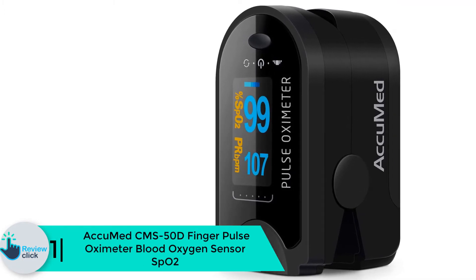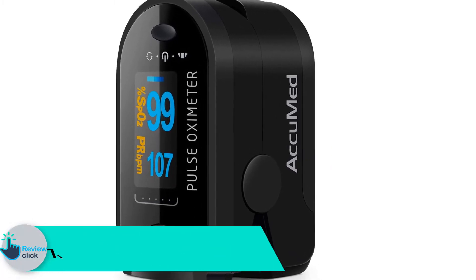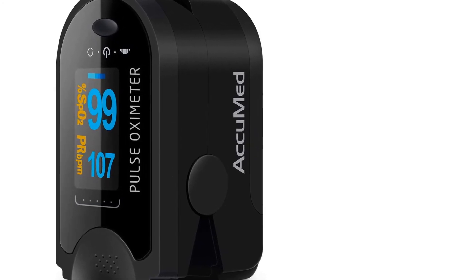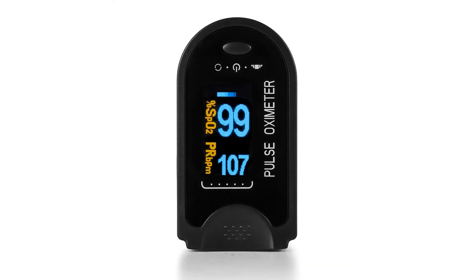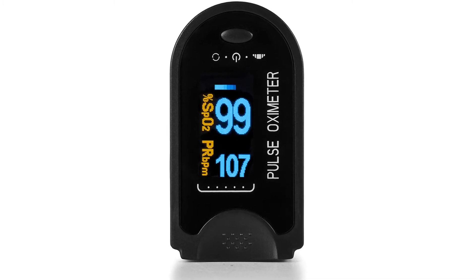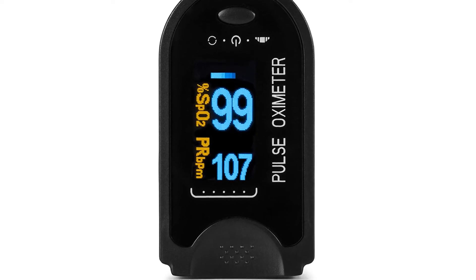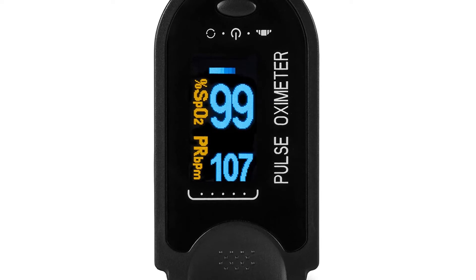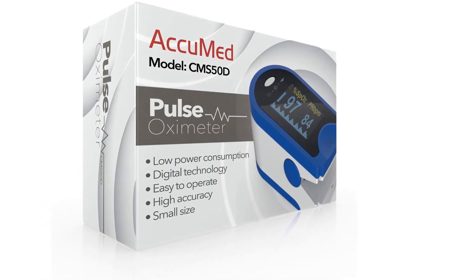Finally, at number 1 we have the Acumed CMS50D Finger Pulse Oximeter Blood Oxygen Sensor SpO2. Acumed brings you convenience when determining blood oxygen level and pulse rate, delivering precise and accurate results. This makes it a great choice for high-demanding tasks and sports. It offers efficient power consumption, lasting 32 continuous hours before changing the batteries.